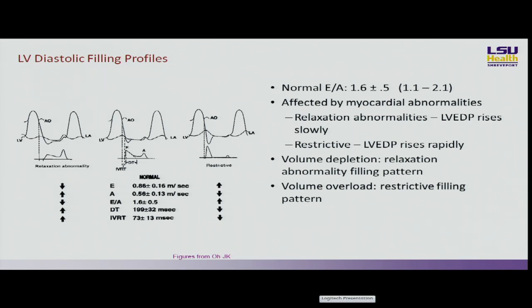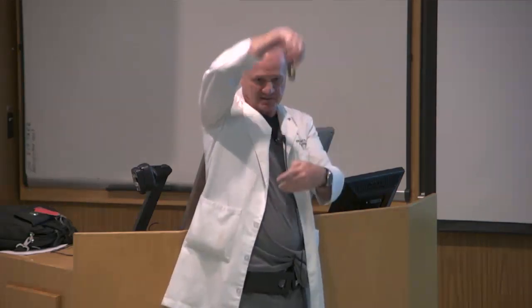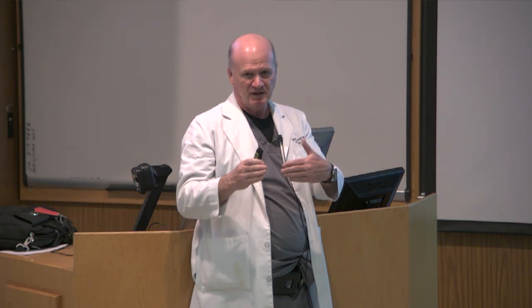The diameter? Yeah, the change in diameter is not as reflective of the actual volume change as Doppler is. Right. In the IVC itself, it's perpendicular. So you have to hit the hepatic vein because it's coming longitudinal to your transducer. If you have flow that is perpendicular, you measure 0. And to get most accurate flow, you have to be within, as I'll show you, 20 or 25 degrees.